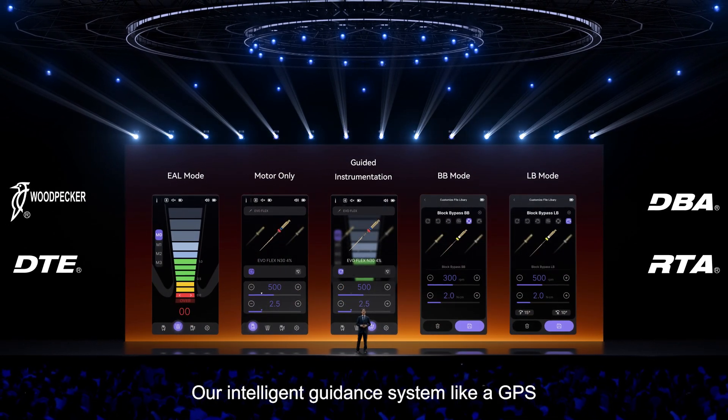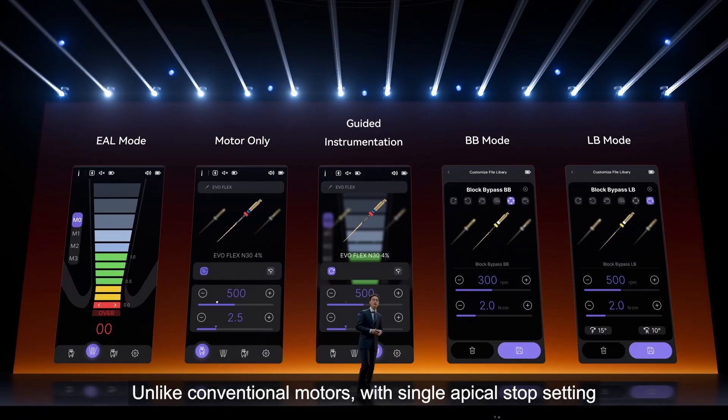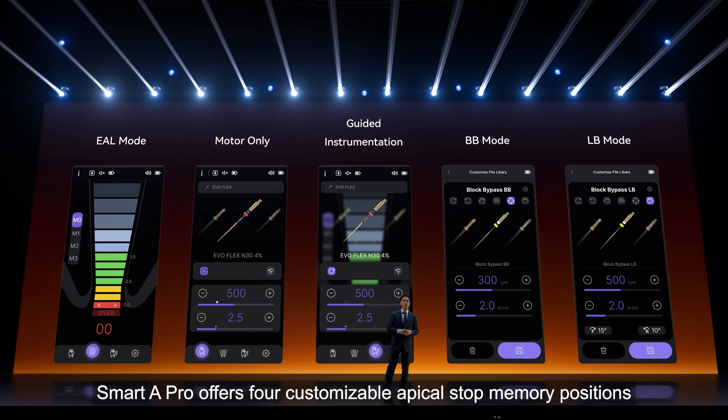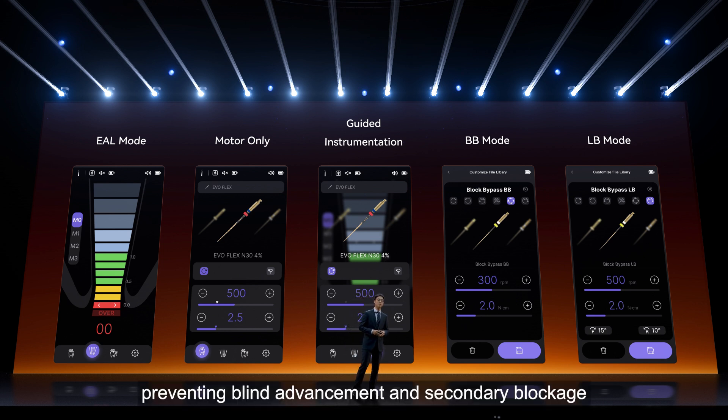Our intelligence guidance system acts like a GPS for your root canal treatment. Unlike conventional motors with a single apical stop setting, Smart A Pro offers four customizable apical stop memory positions. BB mode pauses every one second to allow debris evacuation, preventing blind advancements and secondary blockage.